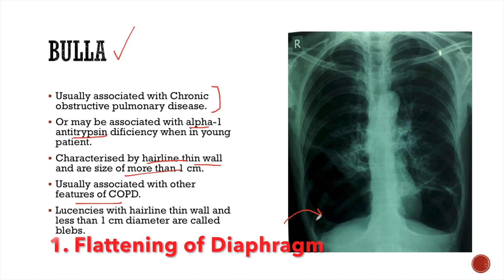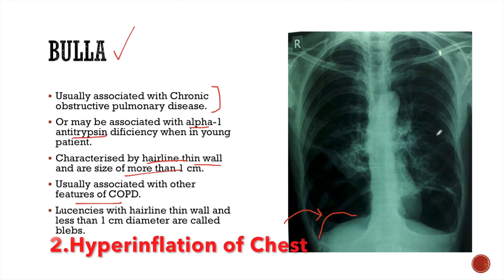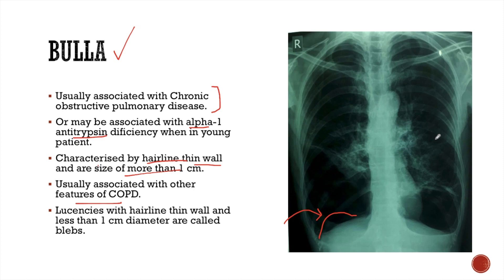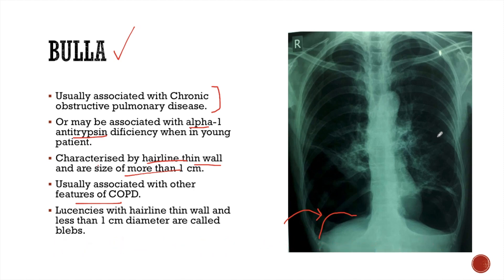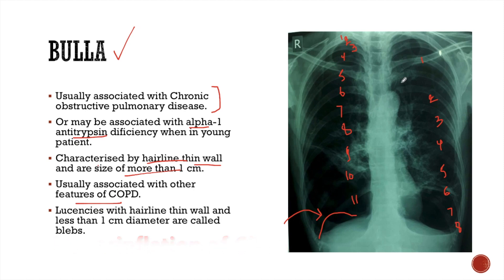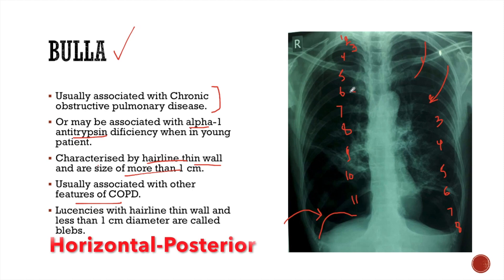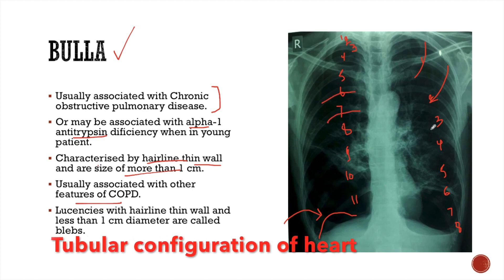Here we can see that there is flattening of the diaphragm. The diaphragm is supposed to be dome-shaped, but here it appears flat. We can also see hyperinflation of the chest. Normally we can see six anterior and ten posterior ribs in the thorax on an X-ray, but here we can see eight anterior ribs and eleven posterior ribs. These oblique ones are the anterior ribs and these horizontal ones are the posterior ribs. We can also see the tubular configuration of the heart.